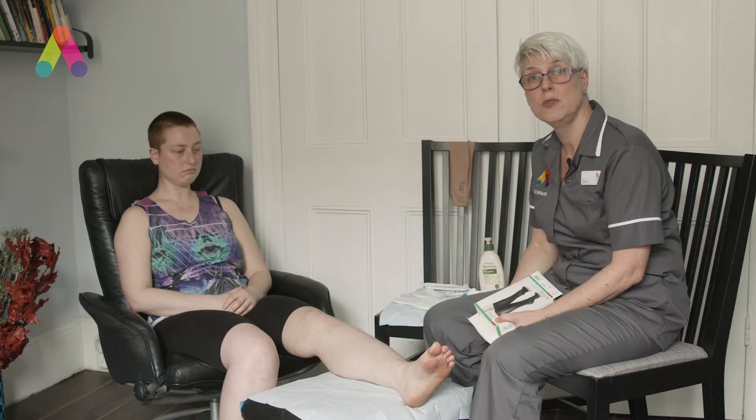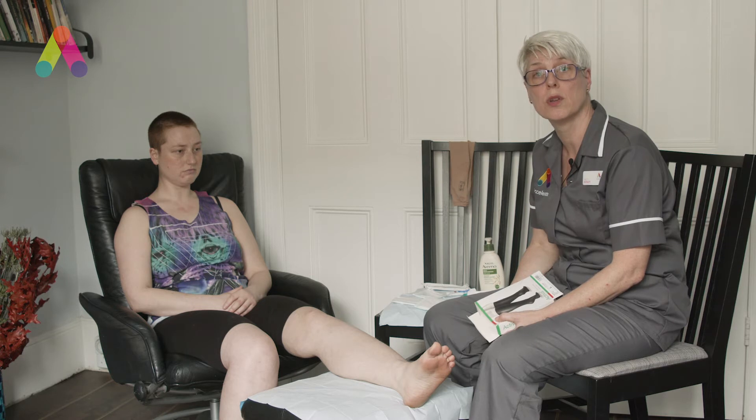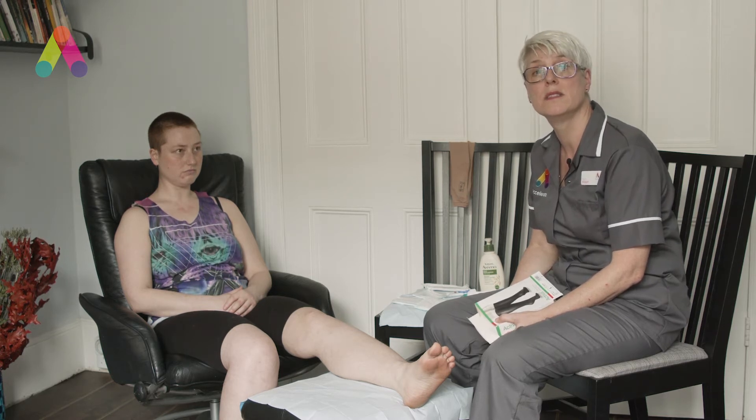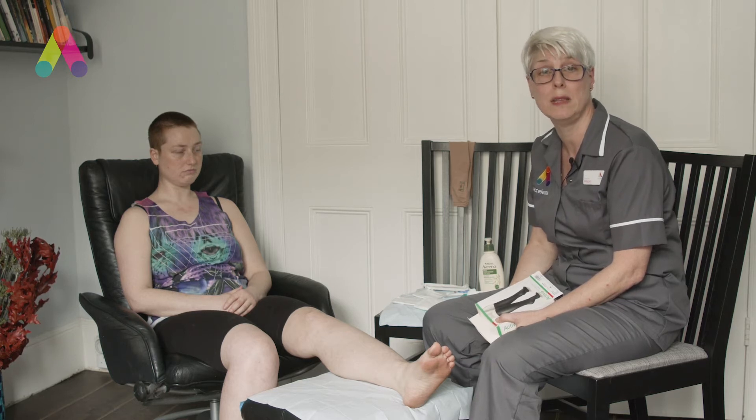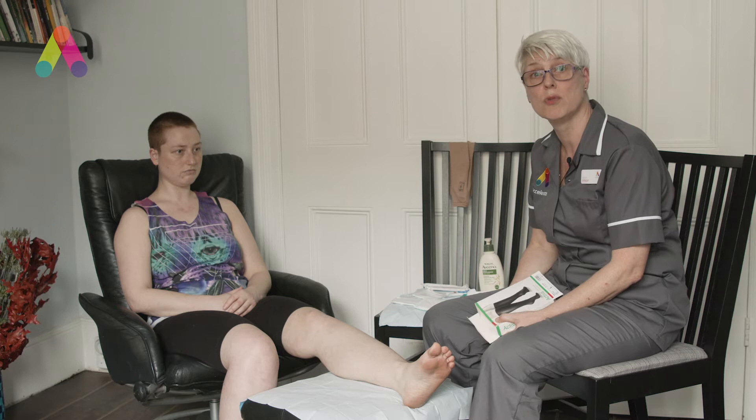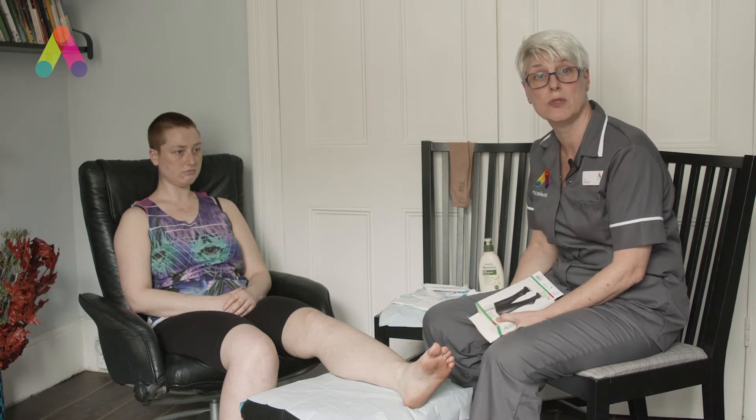Hello, I'm Alison, Chief Exec of Accelerate. This short video is going to help practice nurses in particular use light compression for small lacerations and new wound skin tears on the lower leg. We can use light compression or class 1 hosiery before we have an ABPI. This has been instructed from the National Wound Care Strategy and it's a great leap forward. So this short video is just encouraging its use.